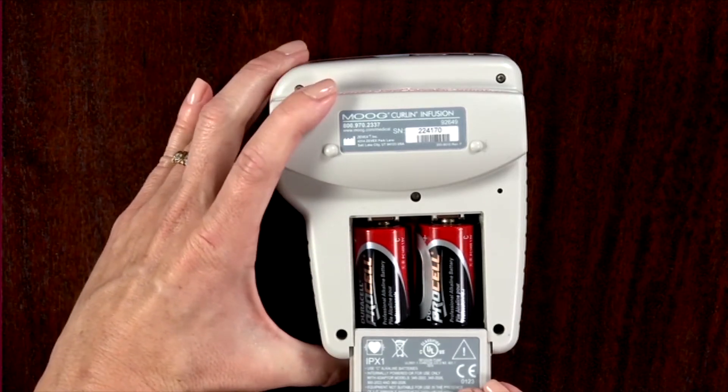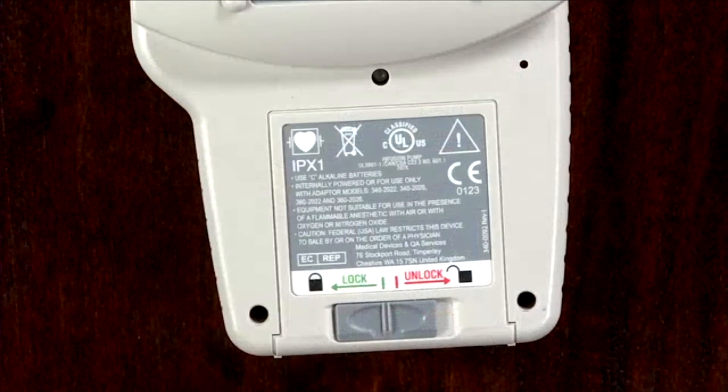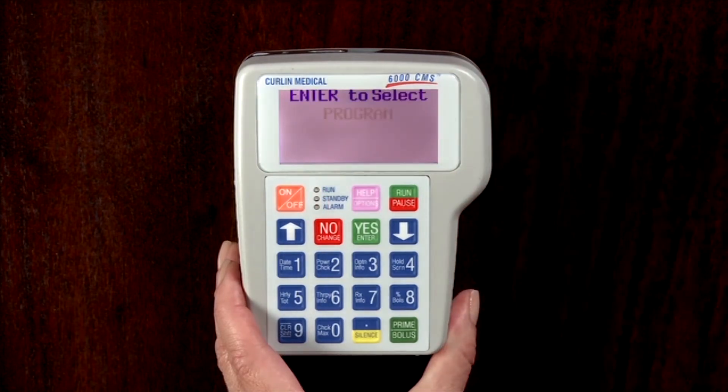Now slide the battery door back in place and push the slide to the locked position. Turn the pump on. Battery power can be checked when turning the pump on after pressing the on/off key. The bar graph depicting the power source for internal power indicates the strength of the batteries.